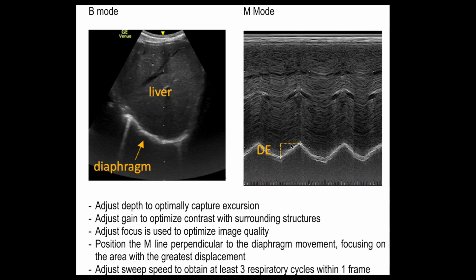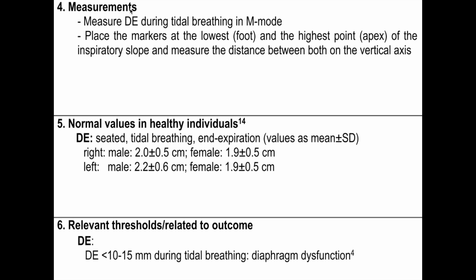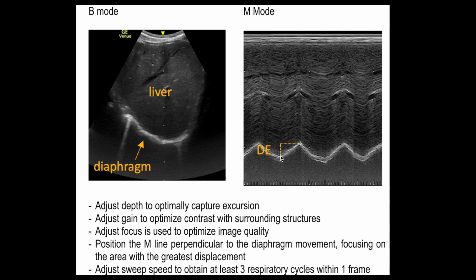This distance is the diaphragmatic excursion. Measure it during tidal breathing in M-mode by placing markers at the lowest point and the highest point of the inspiratory slope and measuring the vertical distance between the two. This vertical distance is your diaphragmatic excursion value.